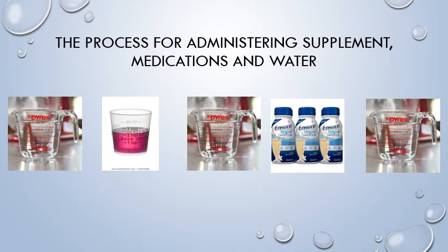Begin with water. The delegating nurse will tell you how much. The initial water flush assures the tube is not blocked. Then administer medications, then an additional water flush to assure medications are not blocking the tube. Then administer the supplement and the final doctor-ordered water flush. This is for hydration. Try to avoid putting air into the person's stomach.